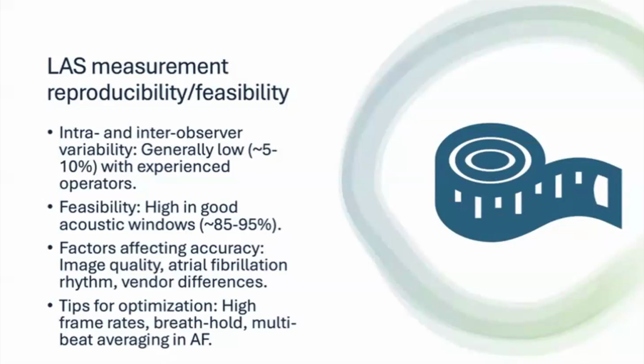Ways to optimize these are things we already do for any of our patients undergoing an echo assessment: trying to average things over multiple frames, breath holding, and more beat averaging when it comes to atrial fibrillation.